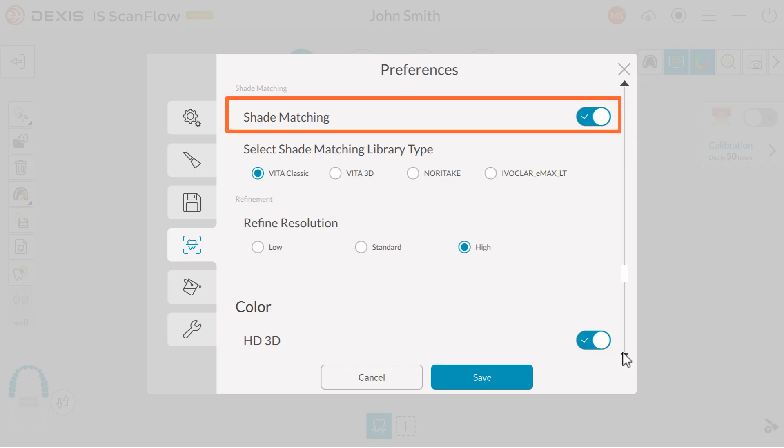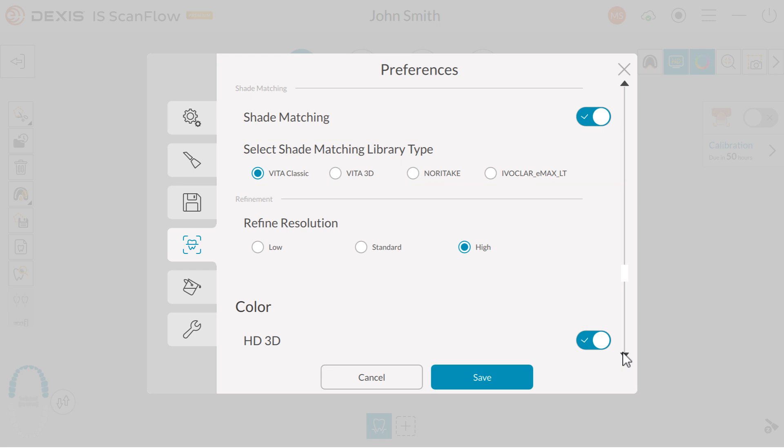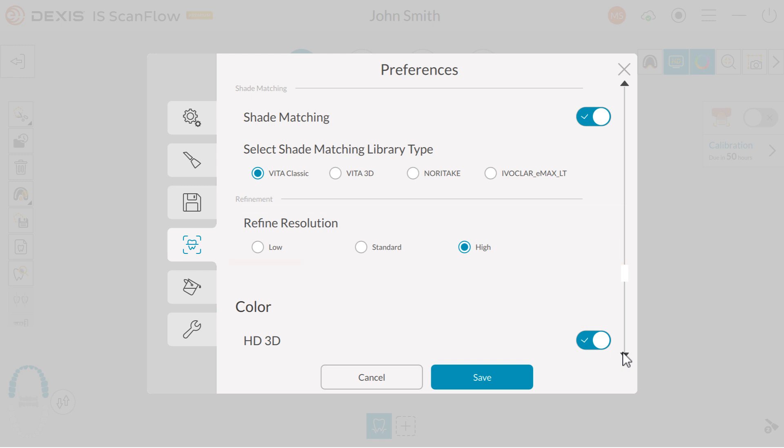If you want to use the scanner as a shade guide, select the shade matching library that you plan to use. Select the Refine resolution default for your scans. Low resolution tends to be used for models. Standard is designed for appliances. And high is ideal for crowns, ridges, and implants.